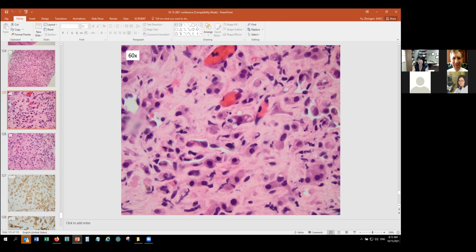Hepatocellular carcinoma cells are large, with a trabecular arrangement, big trabecular, microtrabecular arrangement. Sometimes it's really challenging. So we have a new entity called hepatocellular neoplasm NOS. Yeah. So this entity sits between hepatoblastoma and hepatocellular carcinoma. Sometimes challenging.